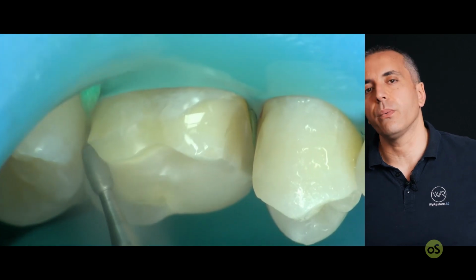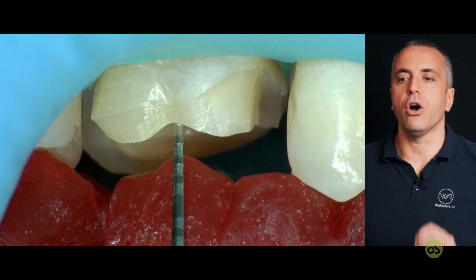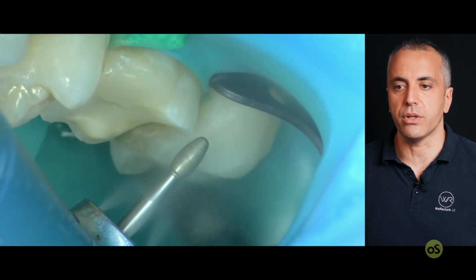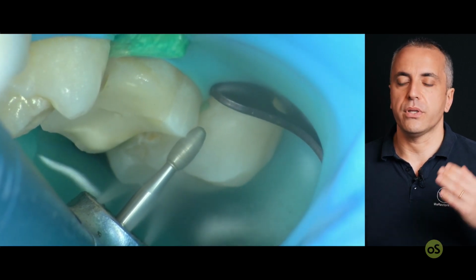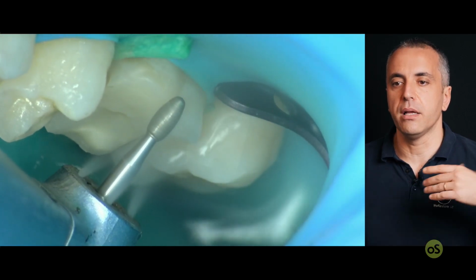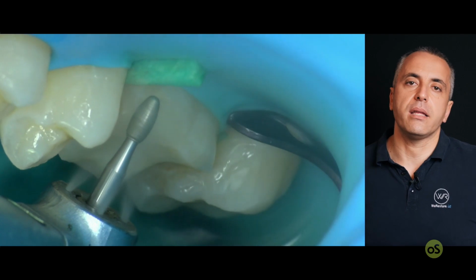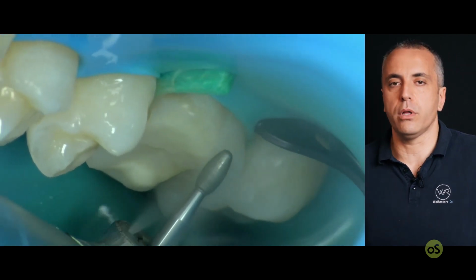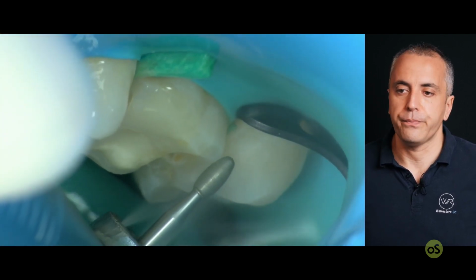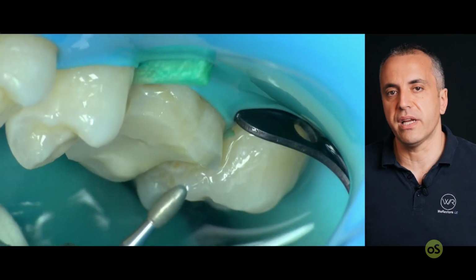One important thing to consider when we talk about adhesive restoration, not focusing particularly on some material, is that we want rounded edges. Once again, we are checking the thickness with the occlusal. We don't want the straight angles, because everything has to be smooth, no tension inside, so the cement can flow away smoothly. And it is not like in the golden era, where there were those wonderful gold inlays, gold onlays, wonderful treatments, but there was no adhesive dentistry.